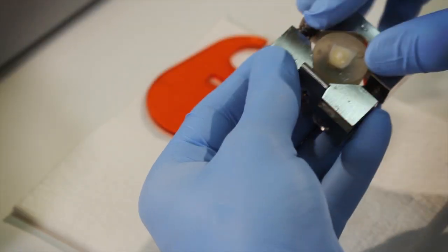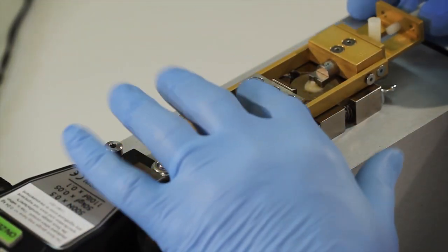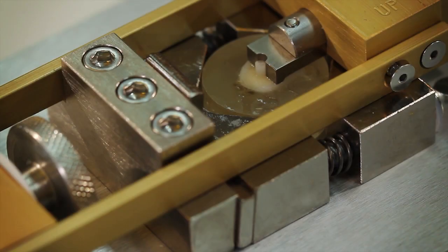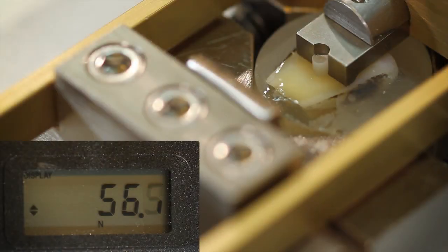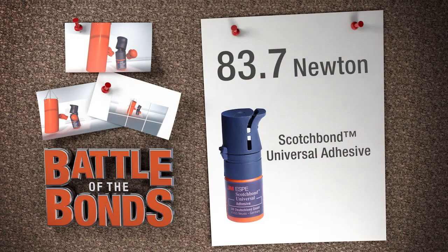Each sample was placed in a clamp and loaded into the portable shear bond strength testing unit. The wheel was slowly turned, bringing the shearing mechanism into contact with the composite. Once the Start Test button was pressed, the shearing force against the composite was gradually increased until the composite de-bonded. The force required to break or de-bond the samples was recorded in newtons on the electronic gauge. In this example, 83.7 newtons was the force needed to de-bond the composite using Scotch Bond Universal Adhesive.